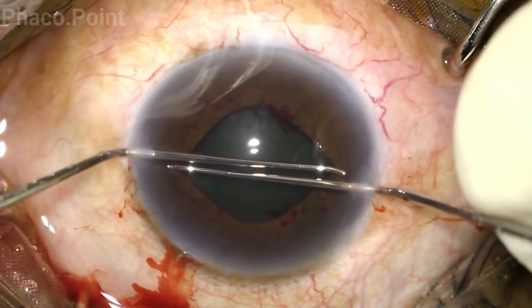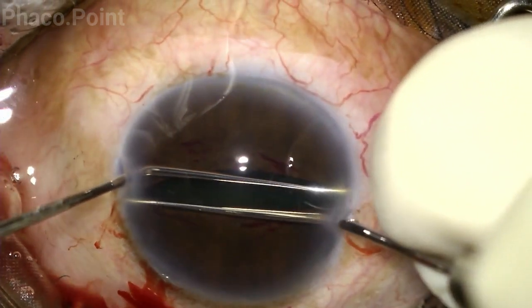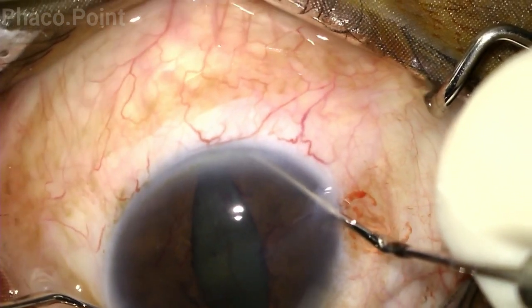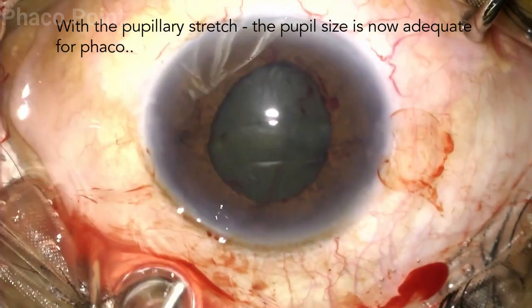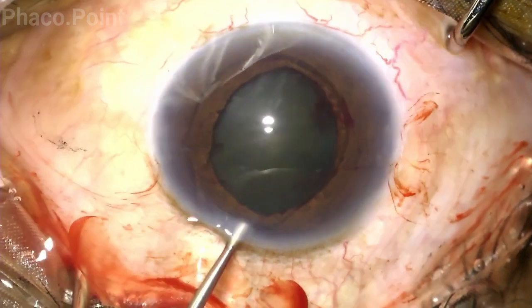It's important to remember that whether you're using a pupillary dilating device or any other mechanical maneuver to open out the pupil, one maneuver or one technique should be adequate to give your pupil large enough to comfortably perform the surgery. Now the pupil seems to be a lot larger — large enough to allow for a very comfortable phacoemulsification.